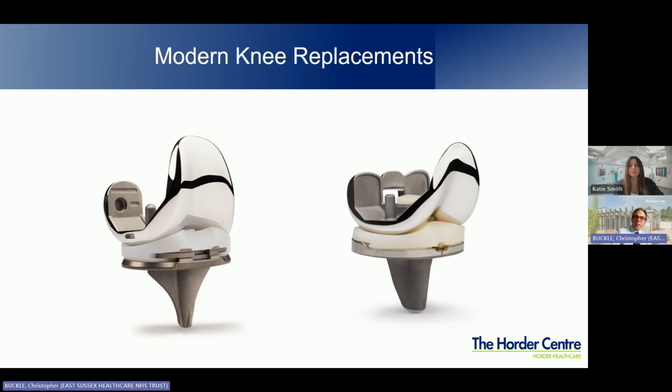But the implant itself recreates that function. Some of the technical aspects of how the bearing surface is congruent with the metal surface recreates that function. There are types of knee replacement where both your cruciates are completely removed and that function is taken over by the implant itself. And the outcomes of those are comparable to each other. Some of that is surgeon preference as to the type of knee replacement they do and the need to resect those ligaments. So the cruciates actually are less relevant compared to some of the other ligaments.